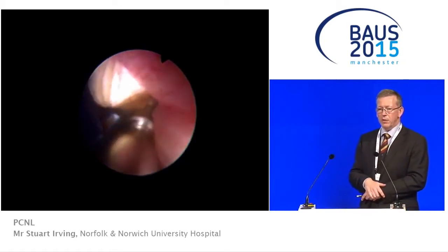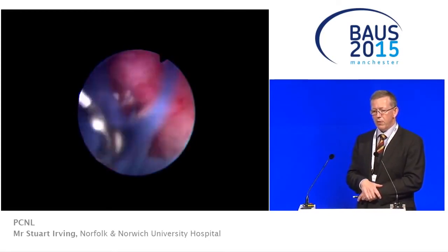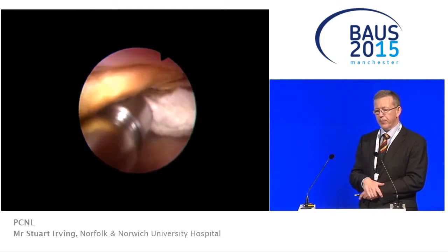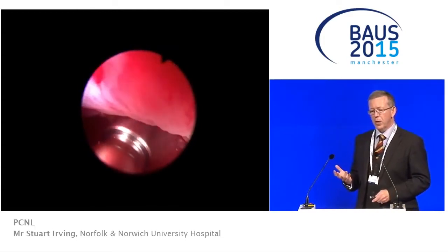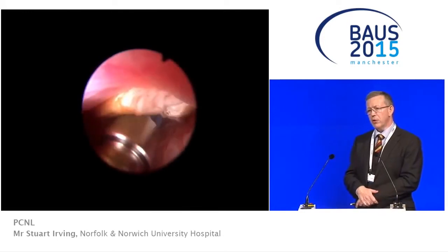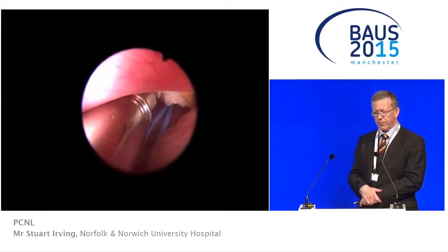To be careful, we can see Will on the flexible ureteroscope poised ready behind, and whilst laser injuries are rare for us, thankfully, we certainly wouldn't want to have to explain a calcuson injury to the flexible ureteroscope. This sort of stone was quite soft. It's clearly an infection stone. It's quite brittle. We've used a combination of calcuson to fragment, but we've also taken fragments out just using a standard pair of grasping forceps.